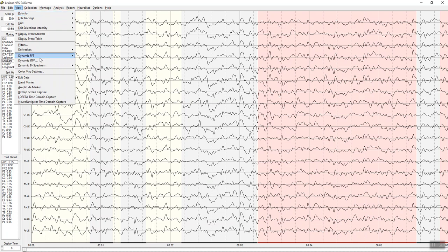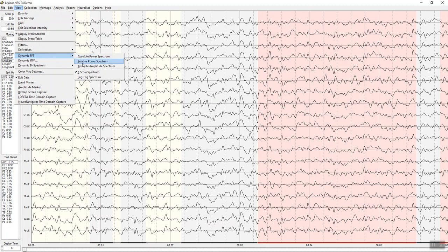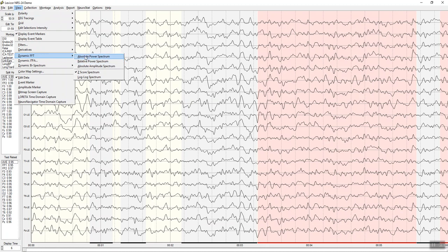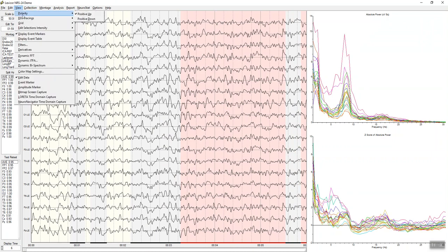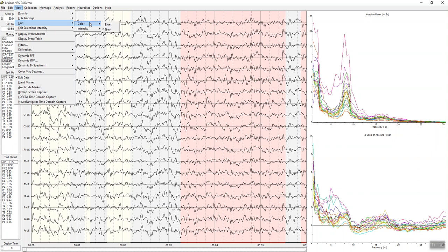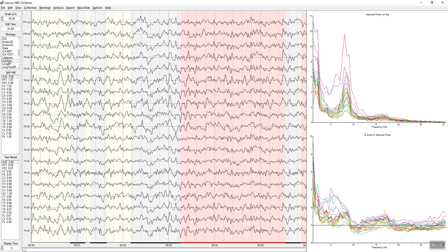At which time you can then compare it to a normative database by clicking on dynamic FFT absolute power, relative power, amplitude spectrum, etc. I'm going to look at the power spectrum. You can change your polarity of the EEG traces, you can change the colors of your traces, you can change the intensity of the color of the grids that you can see, those vertical lines in the visual display. You can change the intensity of the edit selections which you've seen here in the pink.